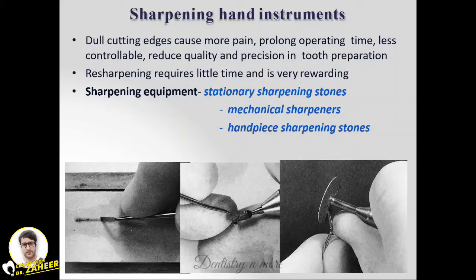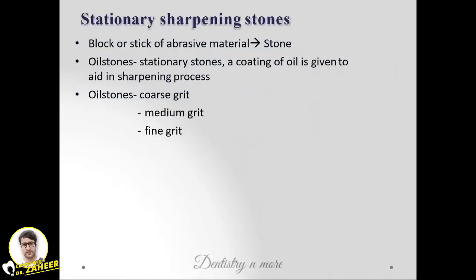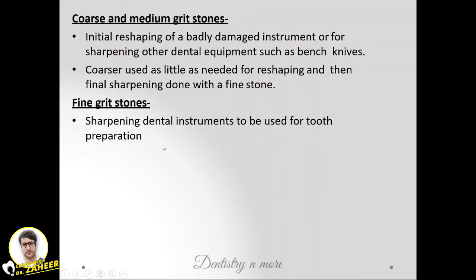So we have basically three types of equipment to sharpen the instruments. One is stationary sharpening stones, then mechanical sharpeners. The last one is handpiece sharpening stones. Stationary stones are blocks or sticks of abrasive material, such as oil stones. A coating of oil is given to aid in the sharpening process. They are of coarse grit, medium grit, or fine grit in nature.